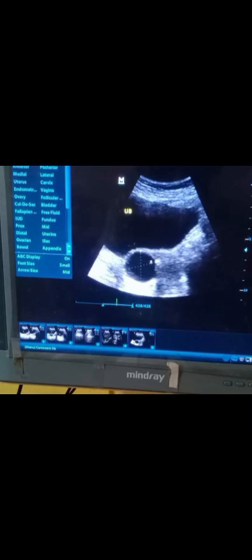Hello and welcome to another interesting video of my YouTube channel. This video is all about ultrasound of the ovaries and the findings of the ovaries. The most common finding we see in our report is a dominant follicle inside the ovary.